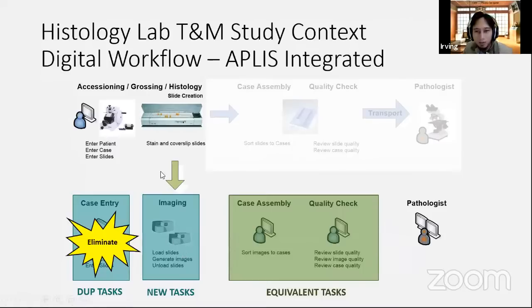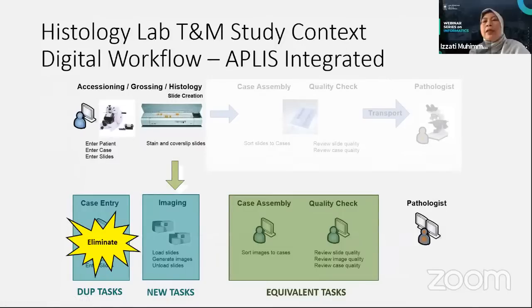I think we have another question. This one is from Miss Rohana. She asked about the rules in Indonesia: does each hospital or institution need to build their own image retrieval system, or is there a standardized data center for this kind of pathology diagnosis?